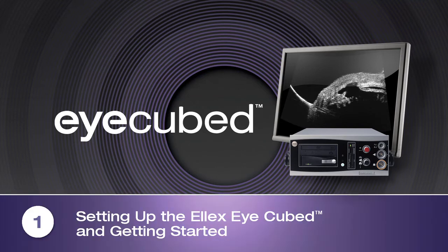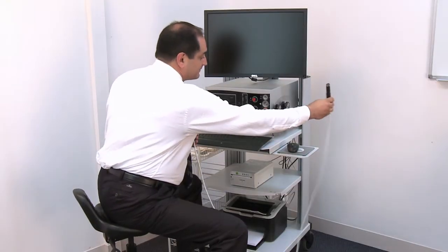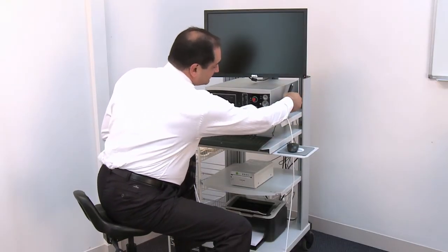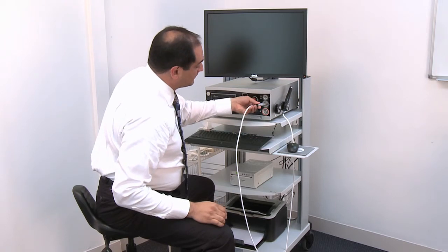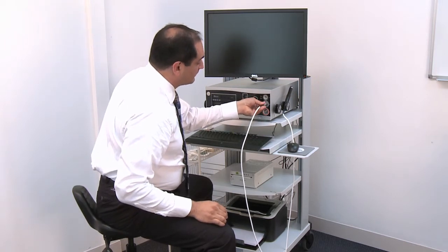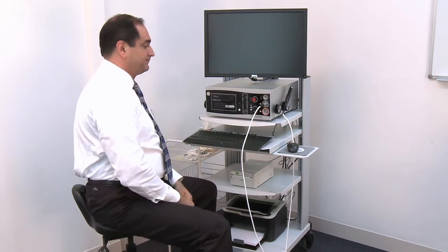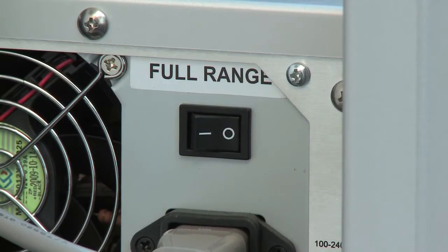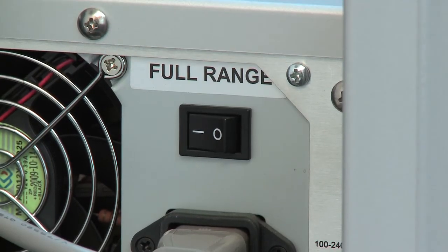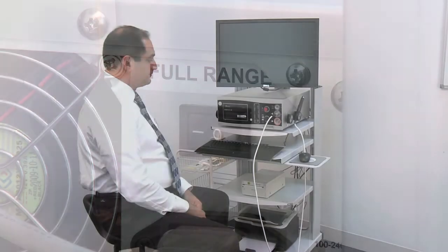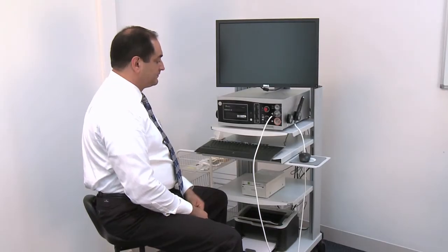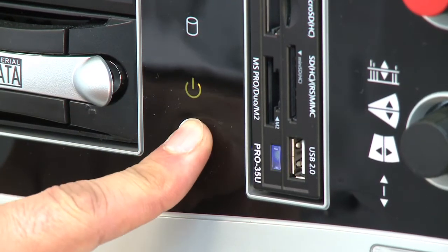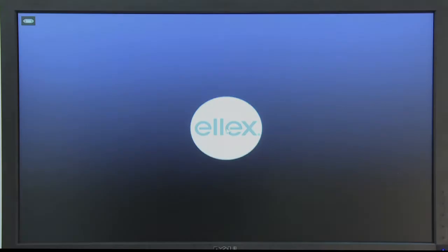Setting up the LX iCubed and getting started. Ensure all accessories, i.e. probes, footswitch, keyboard, are properly connected to the iCubed and that the main power switch on the back of the iCubed console is on the 1 position. Turn the system on by pressing the power button on the front panel of the iCubed console.